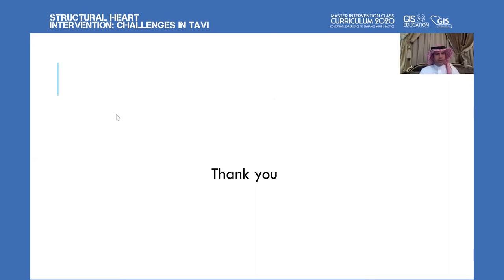Thank you so much. I just want to say, we really discussed the mechanism at length. And I think our conclusion is what Dr. Lafont said. It's that watermelon seed effect, where the valve is just squished at the bottom, and that allowed it to jump. I think the deployment was, if anything, deep, but it was squeezed and the leaflets did not split, and that's why it migrated. There was no resistance, Dr. Wael. Yes, I agree with snaring with two snares, but there was no resistance with one snare. So we figured it was good, and the patient was in the right direction.